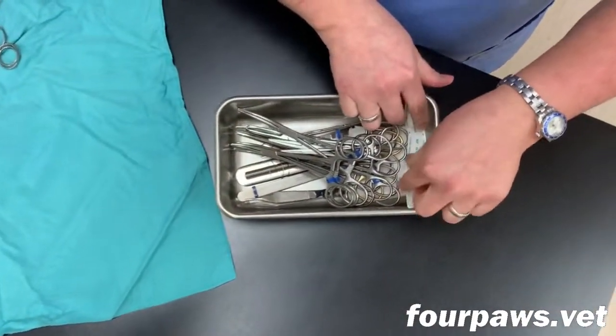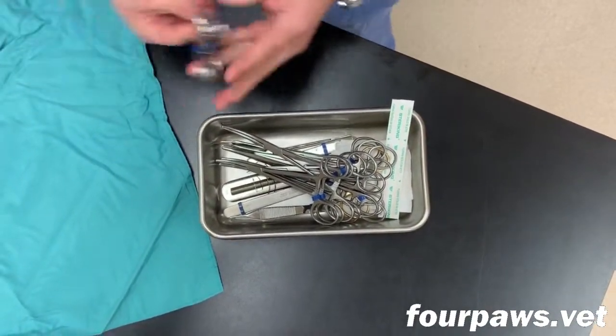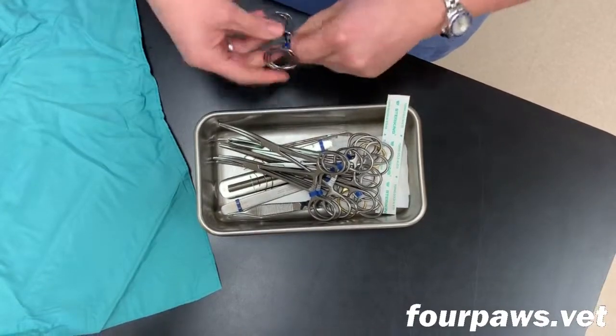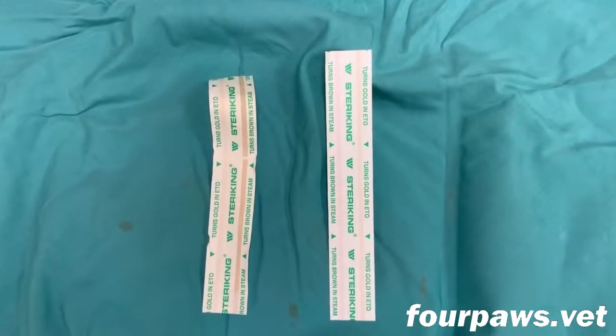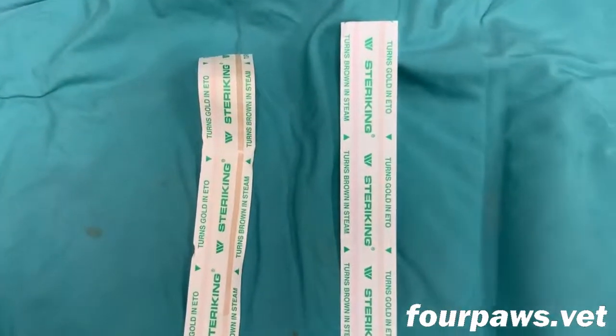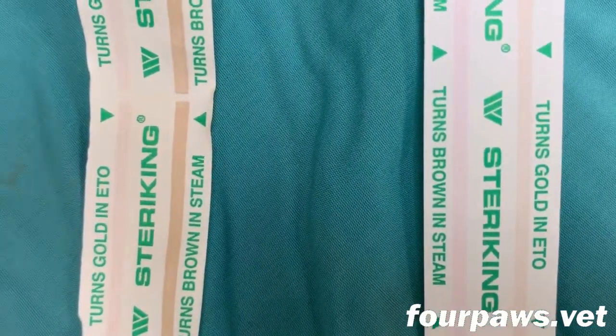An indicator strip is also placed inside the tray as this will help us determine whether or not the pack was properly sterilized when it's unwrapped. On the right is a strip that has not been sterilized yet and on the left is a strip that has been sterilized.